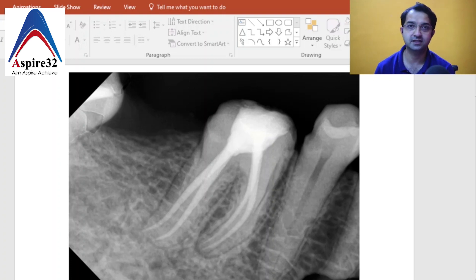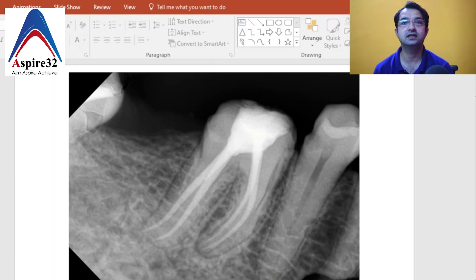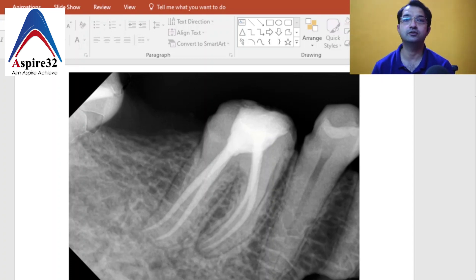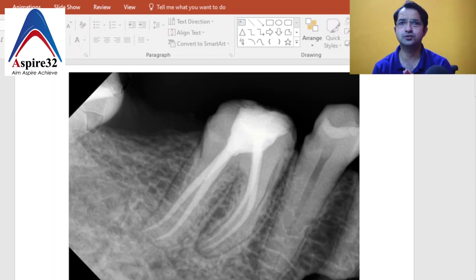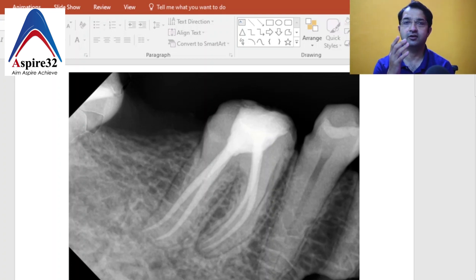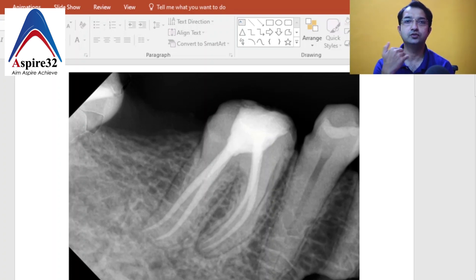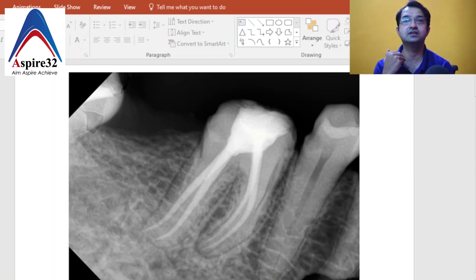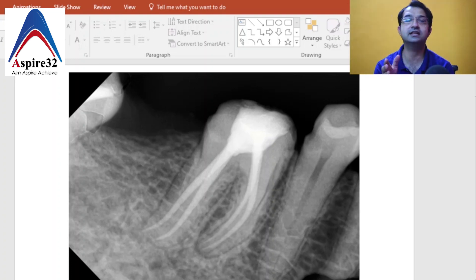All of us have difficulty identifying which is the buccal canal and which is the lingual canal — whether during diagnosis, root canal working length estimation, or even after obturation. There are many times you have a radiograph of a treated root canal and the patient asks you which canal is under-obturated, and that becomes very confusing in mandibular molars.